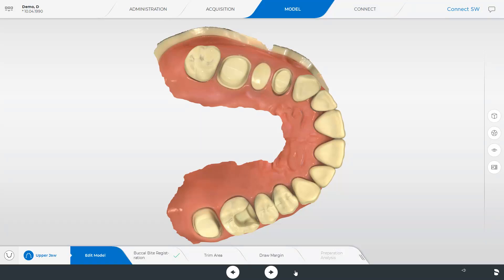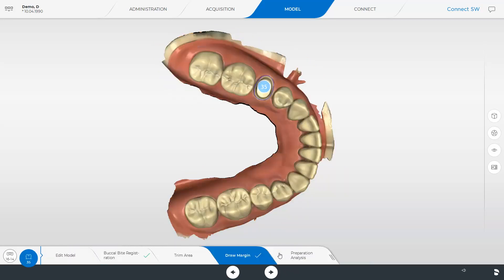It is recommended to draw the margin. Drawn margins are only transmitted after importing the scan data in the InLab software or ExoCAD software. Exported STL data will not deliver drawn margins. We tap the step Draw Margin and then you will see the models with already predefined margins. To view the margins of the bridge as well, we will click the corresponding button on the left edge of the screen.